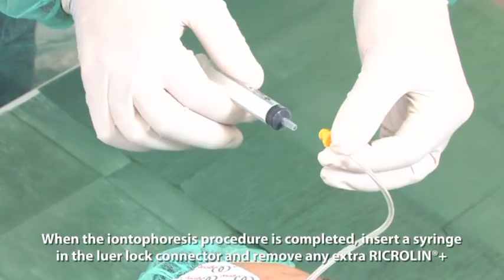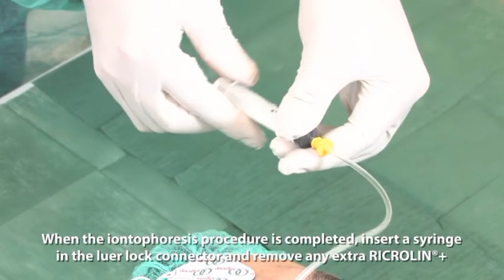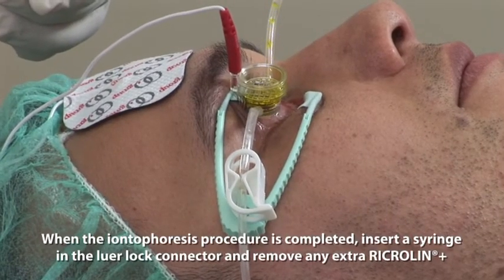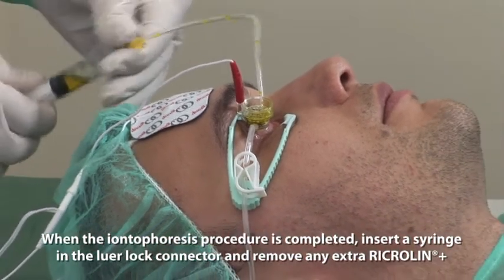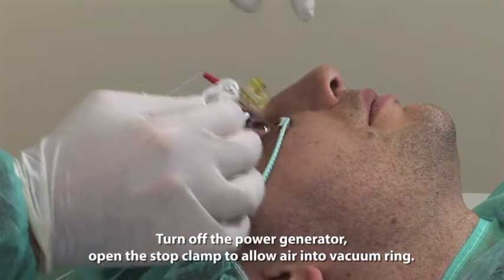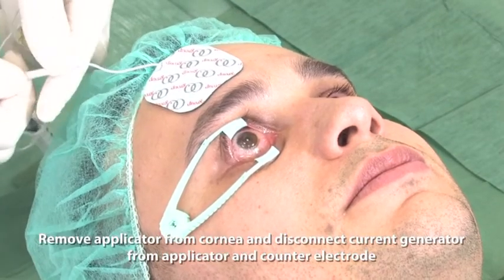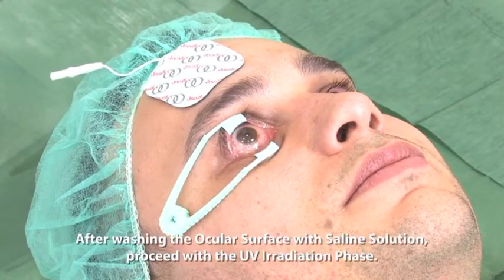When the Iontophoresis procedure is completed, insert a syringe in the luer lock connector and remove any extra Ricrolin Plus. Turn off the power generator. Open the stop clamp to allow air into the vacuum ring. Remove the applicator from the cornea and disconnect the current generator from the applicator and counter electrode.